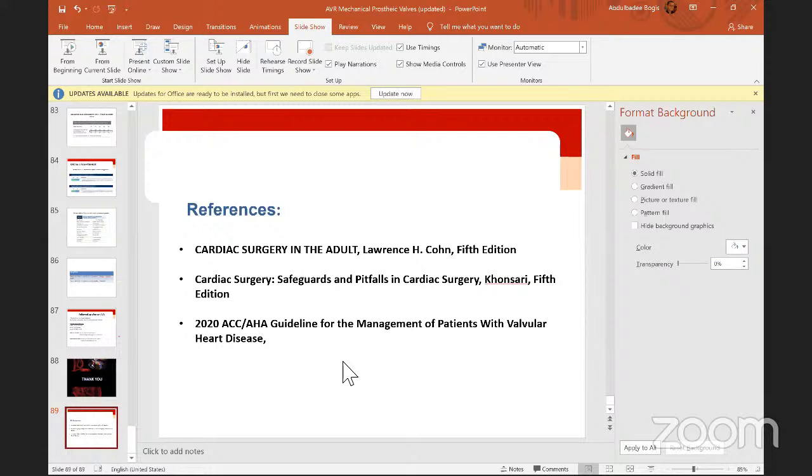Okay. So how about in case you have a small annulus, can we tilt? I've read that we can tilt the mechanical valve toward the greater curvature a little bit. One of the tricks, is this really a good practice, Dr. Rifai? Well, it's not a matter of good practice or not. It's an option. You can go with it and tilt a bit toward the area of the non-coronary and tie your suture over there. Actually, at Toronto General Hospital, one of the surgeons used this technique and I saw him doing it. It is a valid option. There is nothing wrong with that.